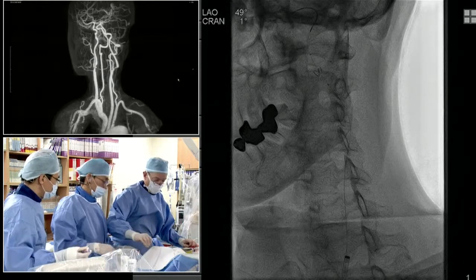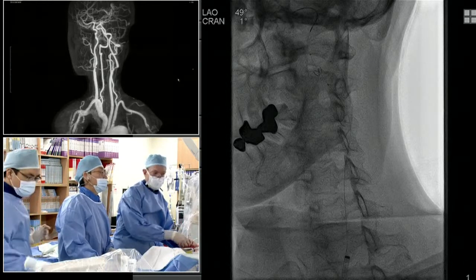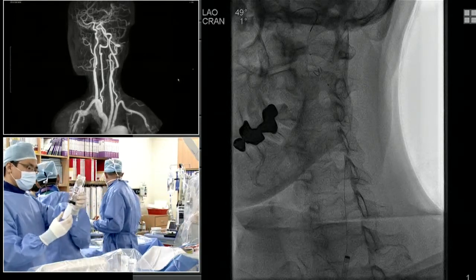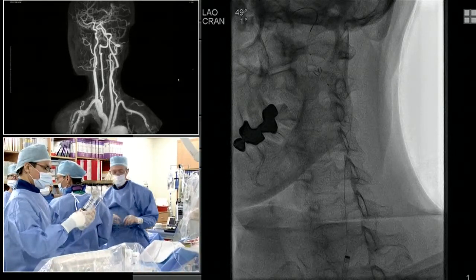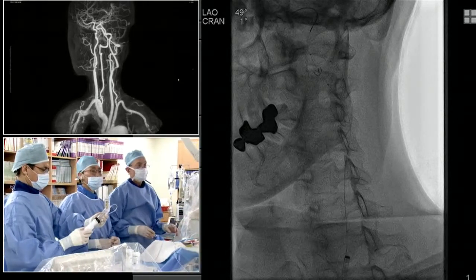How long, usually how long do you inflate a balloon? Just long enough to take... The balloon time is correlated with a kind of bradycardia. So basically, I usually inflate long enough to take a picture.